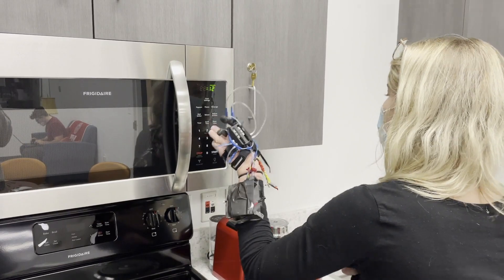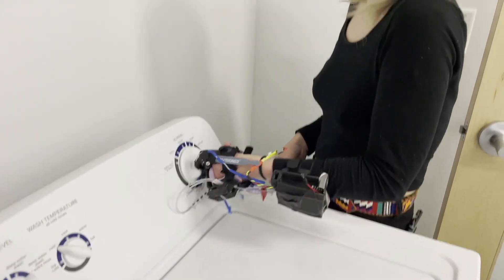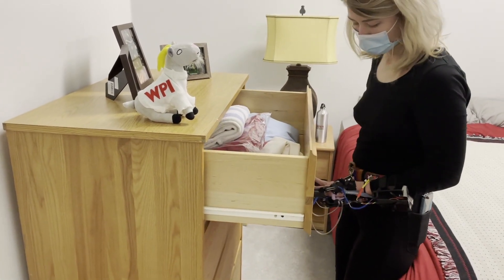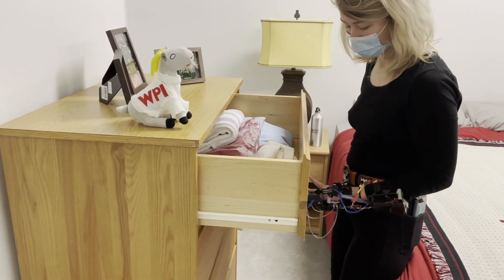Despite the low pinching grip, we were still able to restore many of Peyton's fine motor skills, which are demonstrated here. The findings we've gained from this iteration of the device prove that more dexterous partial hand prosthetics are possible for amputees.